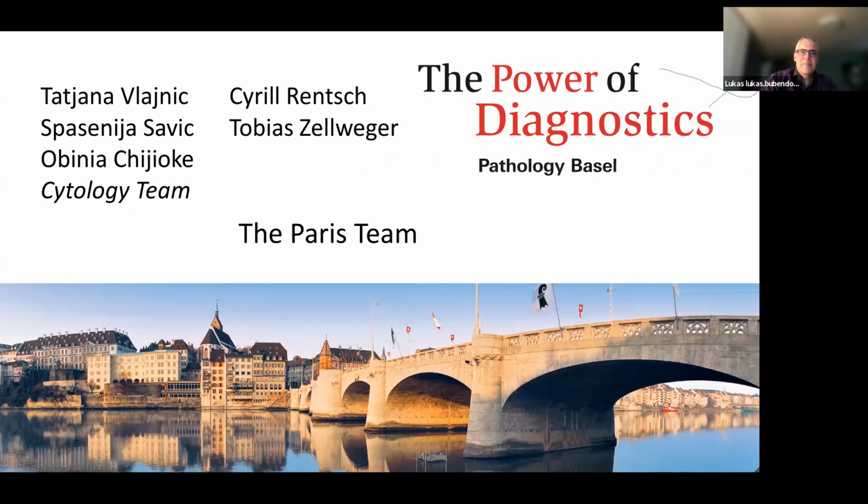Thank you very much, Lukas, for this overview and especially for the practical cases that you showed us. Before we check for questions, I have 2 questions for you. The first one is about immunohistochemistry. Do you change your technical approach to urine if you know that you have to perform immunohistochemistry? For example, if you know that there is a prostatic cancer, do you directly do a cell block, a cytospin, a film prep, and perform immuno on the film prep?